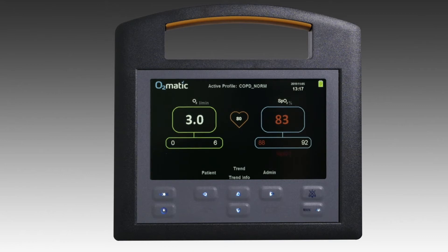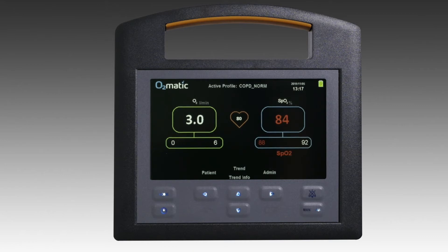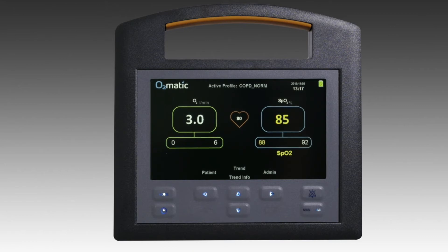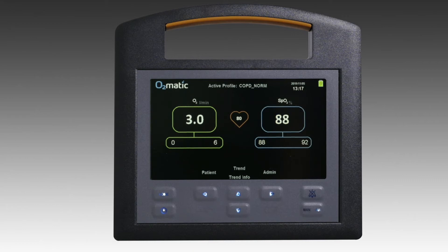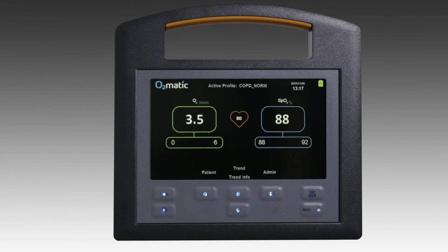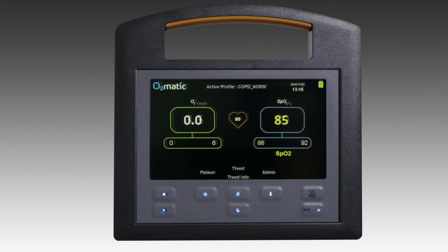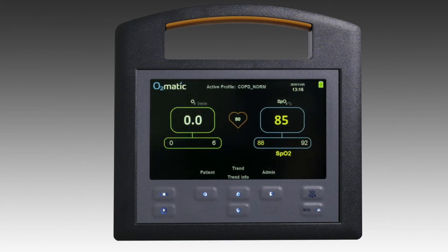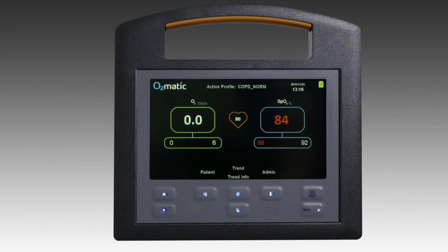Should the patient desaturate, the O2Matic will increase flow of oxygen to the patient. If the patient's saturation is below the target range, the O2Matic will alarm to alert staff.